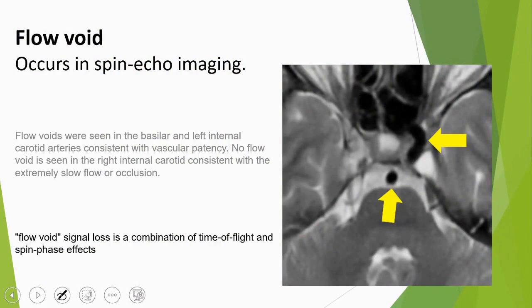The image appears dark, or the blood vessel has become dark, which is called a flow void. When you take any spin echo sequence with any fluid that is moving quickly, faster than the 180-degree pulse and faster than your echo time that you are recording, it has moved from its position. So, in this new place, what will it give you? It will give you a weak signal. So it appears this way.